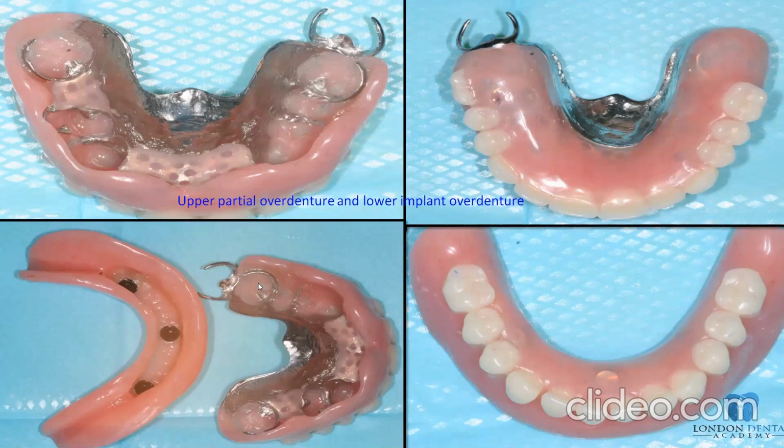If the patient has got loose denture, then we can activate it at some stage. These inserts could be changed. Look at the occlusal scheme, 6 to 6, upper and lower. Very nice, lovely occlusion, simple, straightforward. And that will give the patient another 10, 15 years.